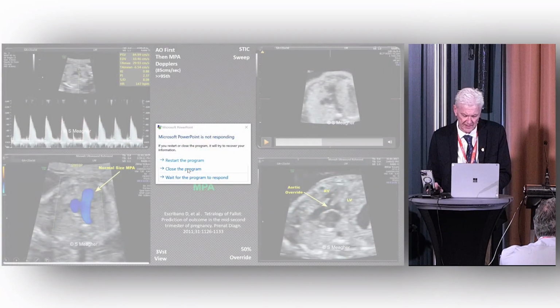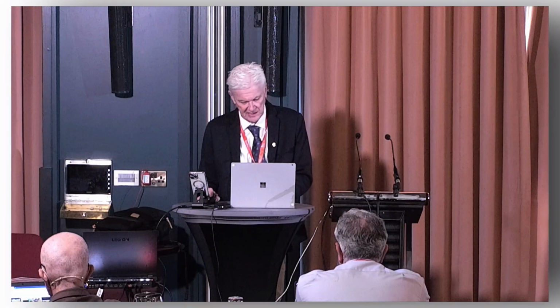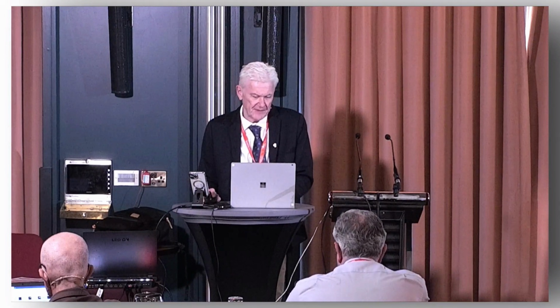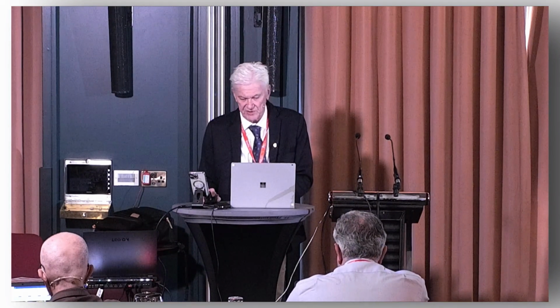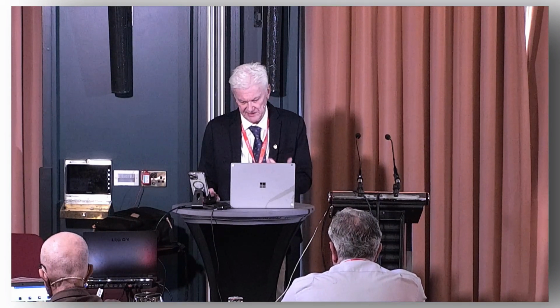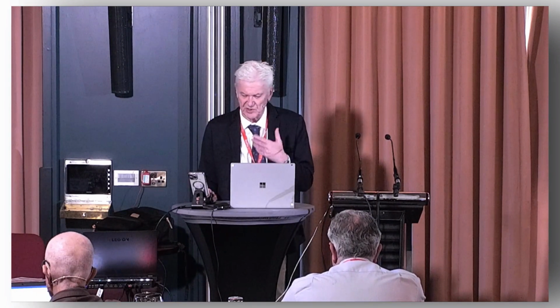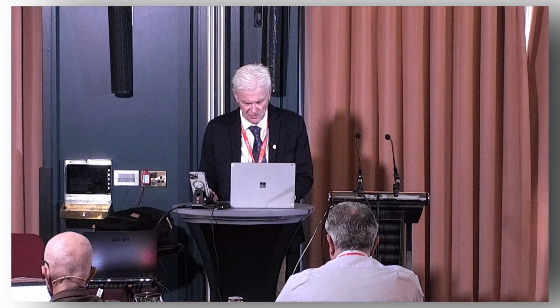And coming across on this, I can see that the pulmonary artery in this case looks of a normal size, but when I pulse Doppler across the pulmonary valve, I want to know, are the velocities increased? Now, I don't go to Rizzo's chart. I Z-score it. Now, these systems, particularly that system we're scanning on, it's so nicely laid out in terms of Z-scoring.